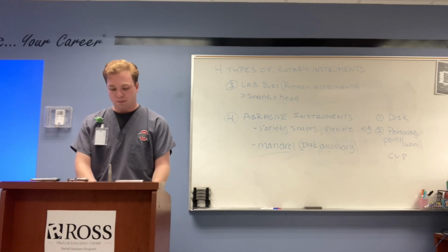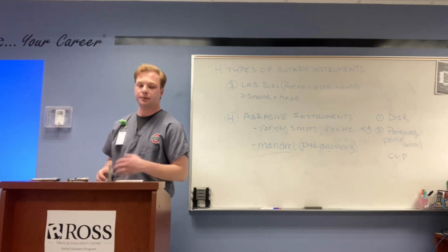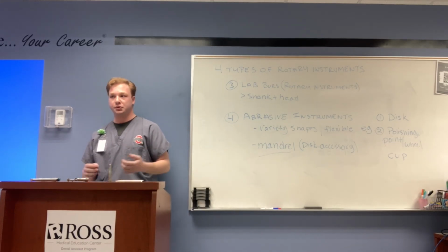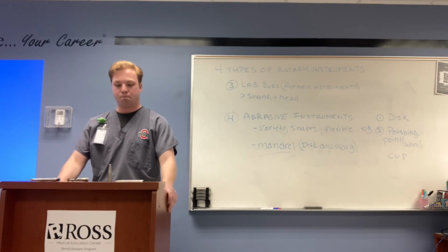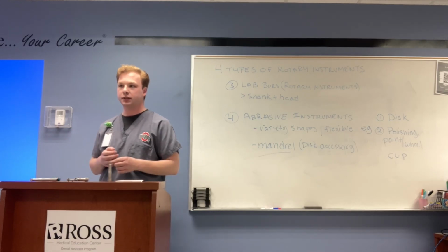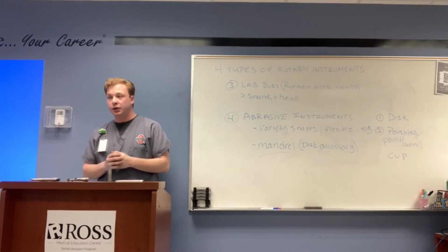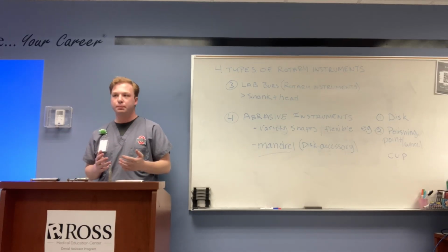So in your dental office, you're going to have to know the types of burrs, what they're used for. You'll need to memorize a couple and what they look like, because a lot of dentists will ask for the same ones over and over and over. But a good rule of thumb is just ask them what burrs they like to use.